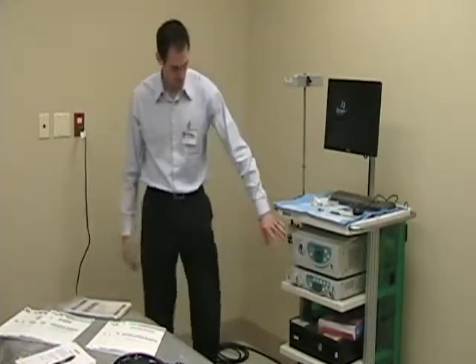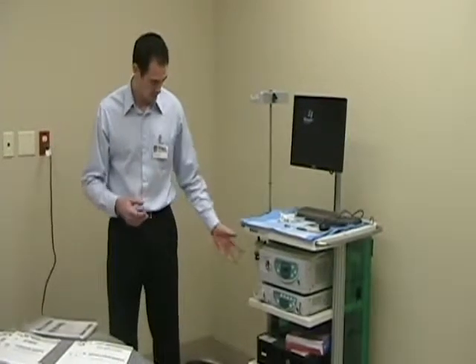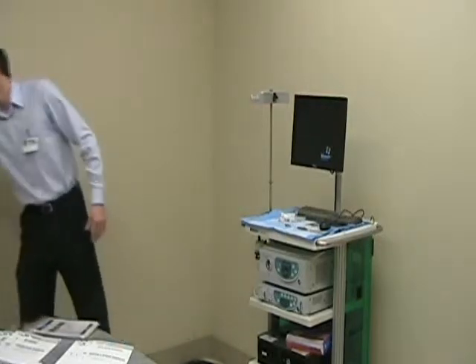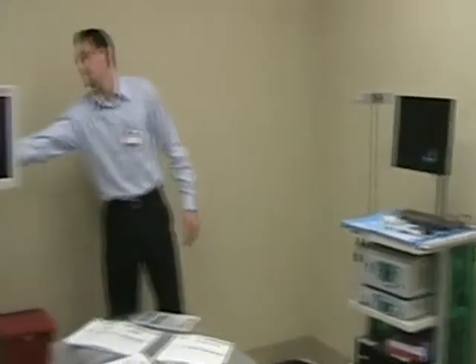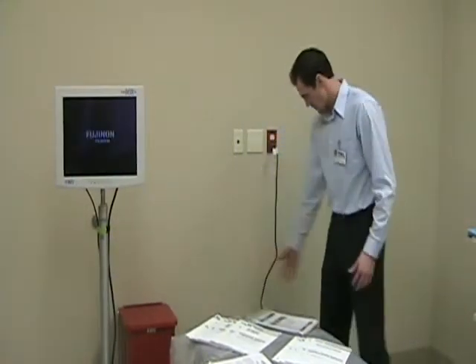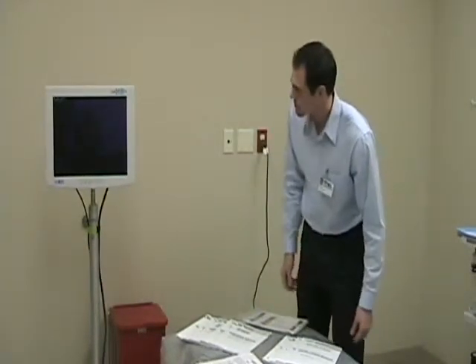Here is the processing unit. This is the XL light source. It's basically just a xenon lamp, high-powered lamp, and a compressor to pump air. So it pumps air, water, light. So pretty simple unit. And then we got the processor down here, which does all the computing, patient information, transferring the image signal, stuff like that. So we got your MDS monitor over here. Real easy toggle switch, turns it on and off. So I'll just turn it on. It's plugged into a DVI cable, which runs the image. So it's got the Fujinon BIOS in it.